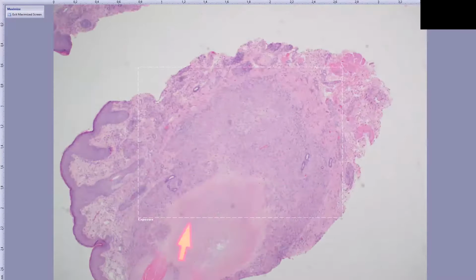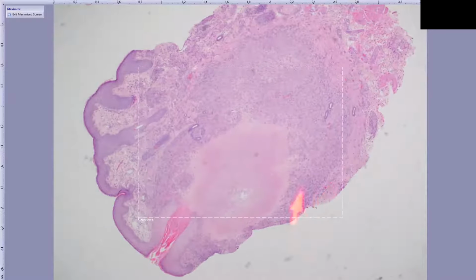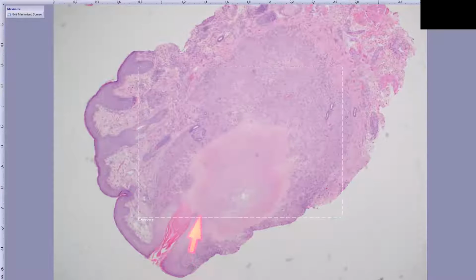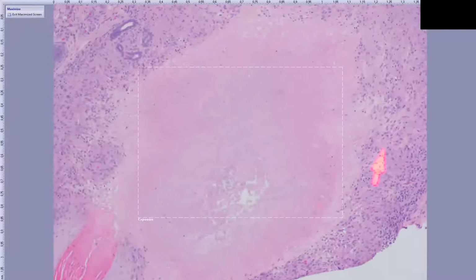And there's an extreme variant of granulomatous rosacea called lupus miliaris disseminatus faciei, where you have frank caseation necrosis. You have a granulomatous infiltrate around the hair follicle, but it tends to be much more dramatic, dense, and you can have complete destruction of the hair follicle as a result of the caseation occurring. And the caseation simply speaks to the necrosis. It's a necrotizing granuloma. You can see sort of that amorphous pinkish colored material, centrally surrounded by these epithelioid histiocytes.